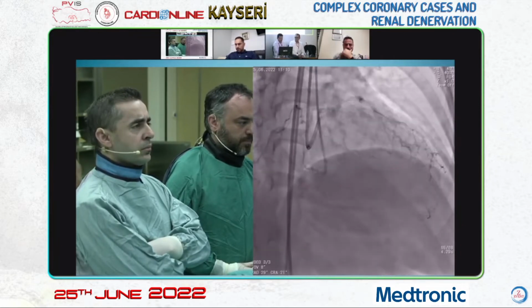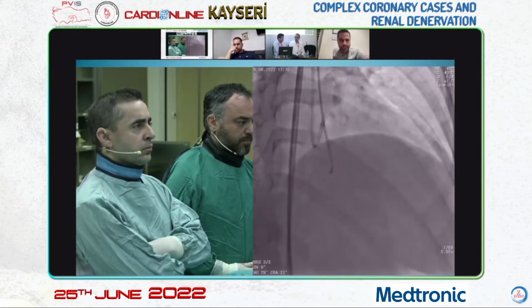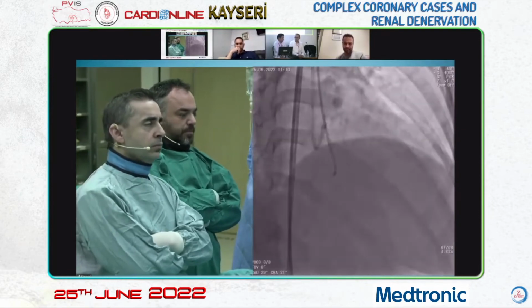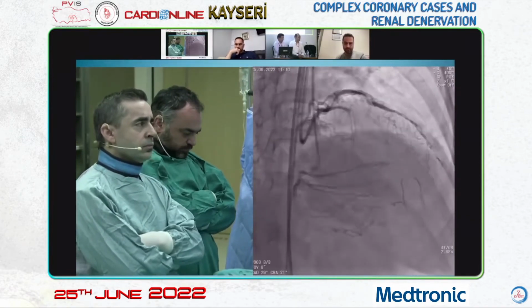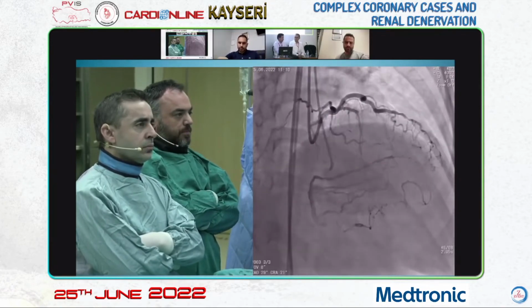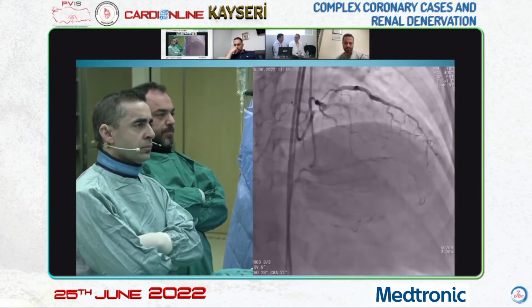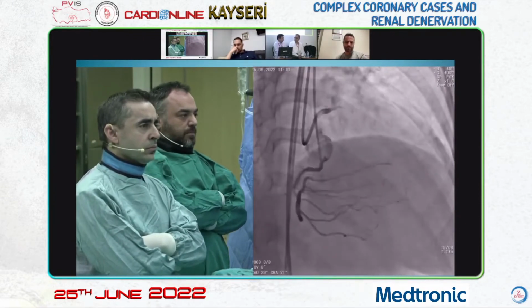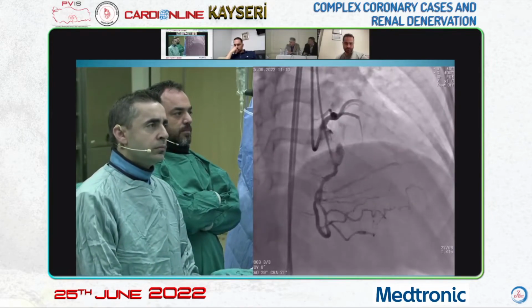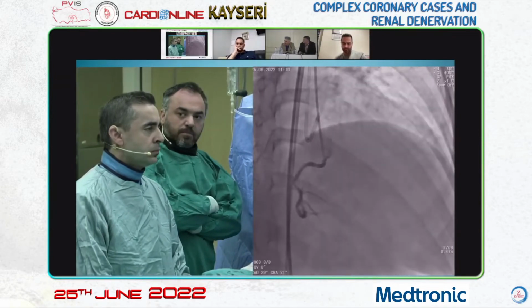And when we puncture the proximal cap with it, the distal will be easier. The distal landing zone is not wide enough. I mean, when we see the wire vessel diameter, it's most probably not a wide one. It will be challenging in re-entry and escalation, what are your opinions about this?